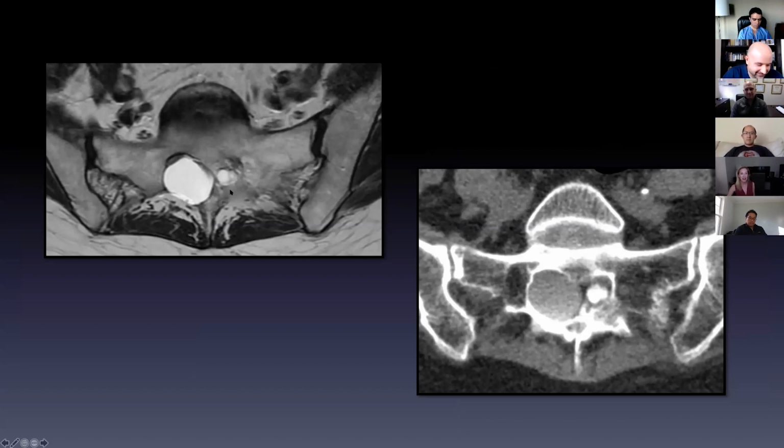This patient came in, neurosurgery sent me this patient, big sacral cyst pushing forward this S1 nerve. They said that the symptoms this patient is having are referable to that nerve. Can you try to drain this? This one I had to do on the CT table because fluoro wasn't available. So I injected my contrast. I'll just show you the axials quickly.